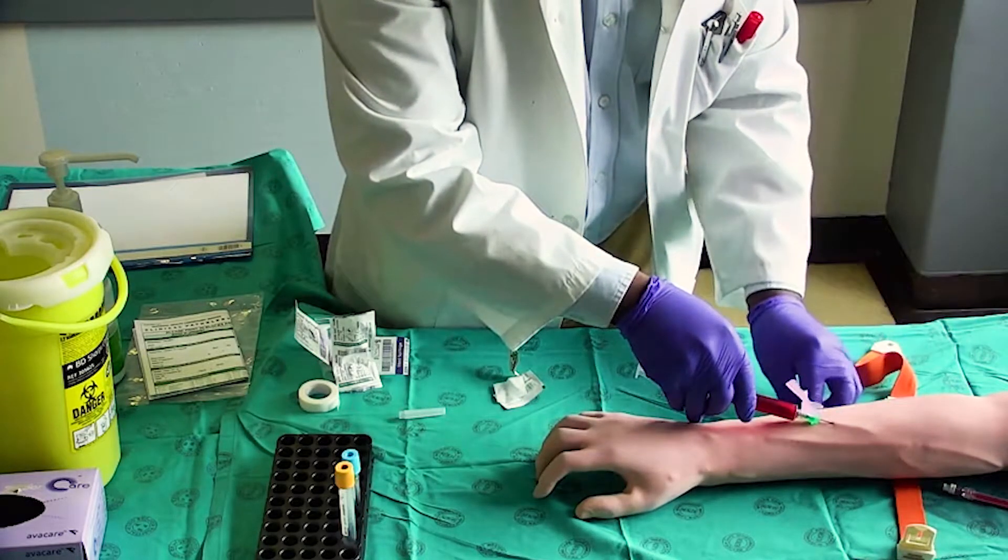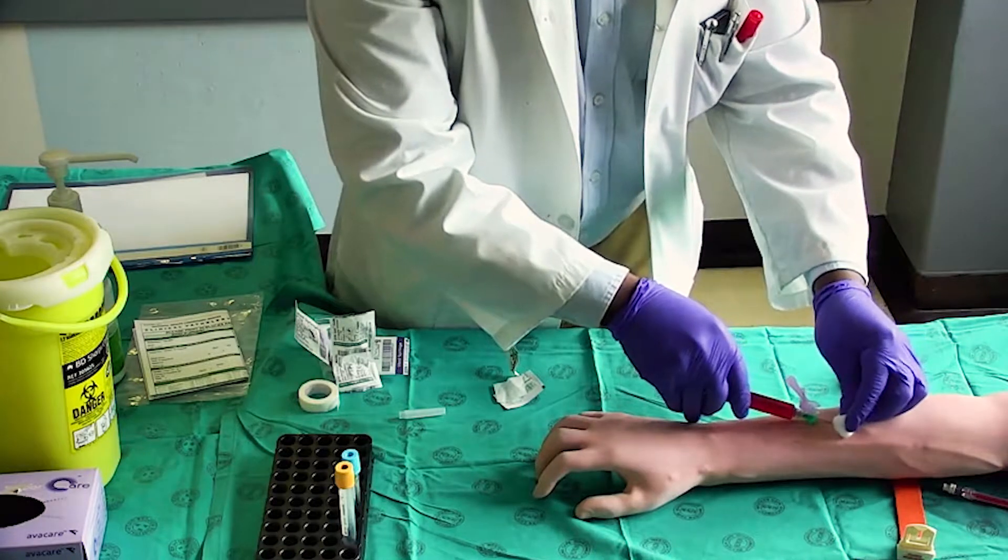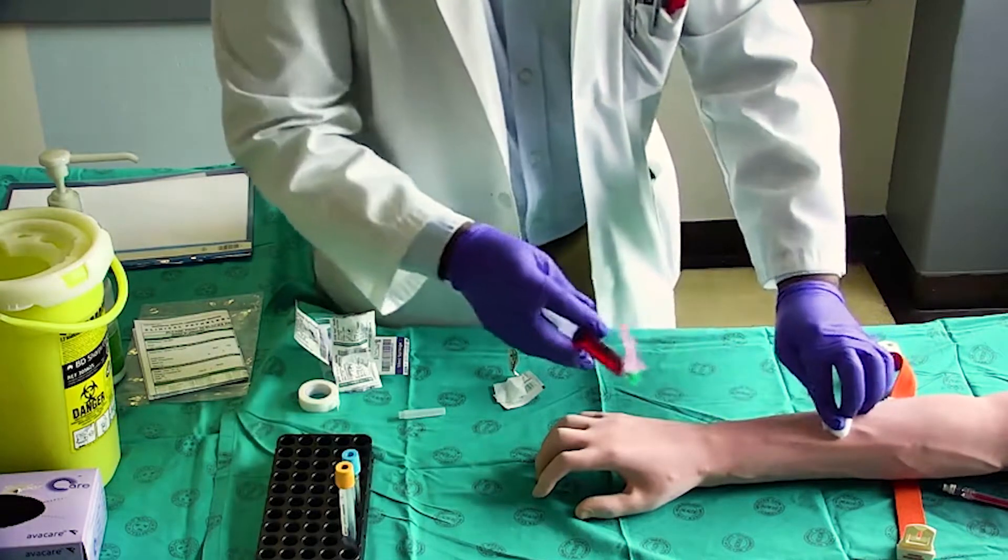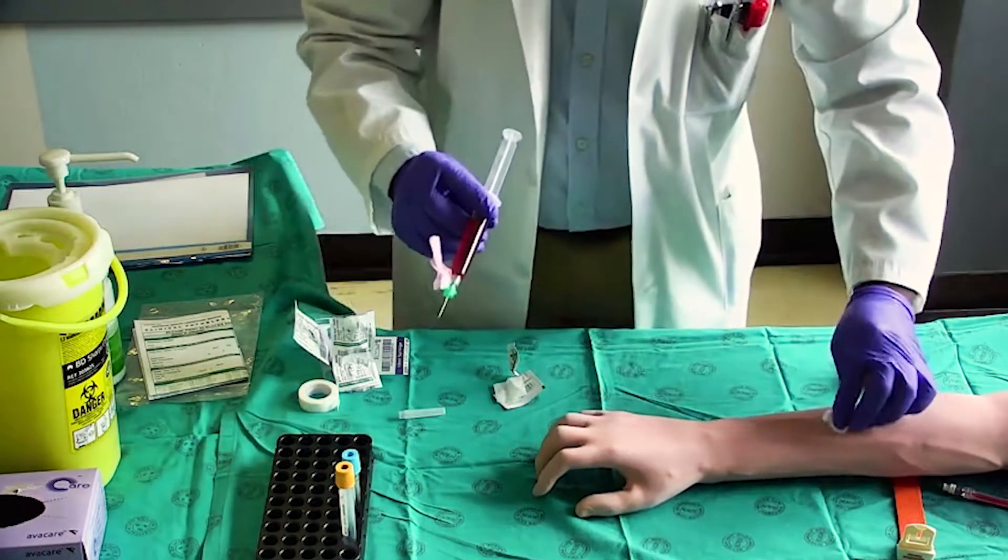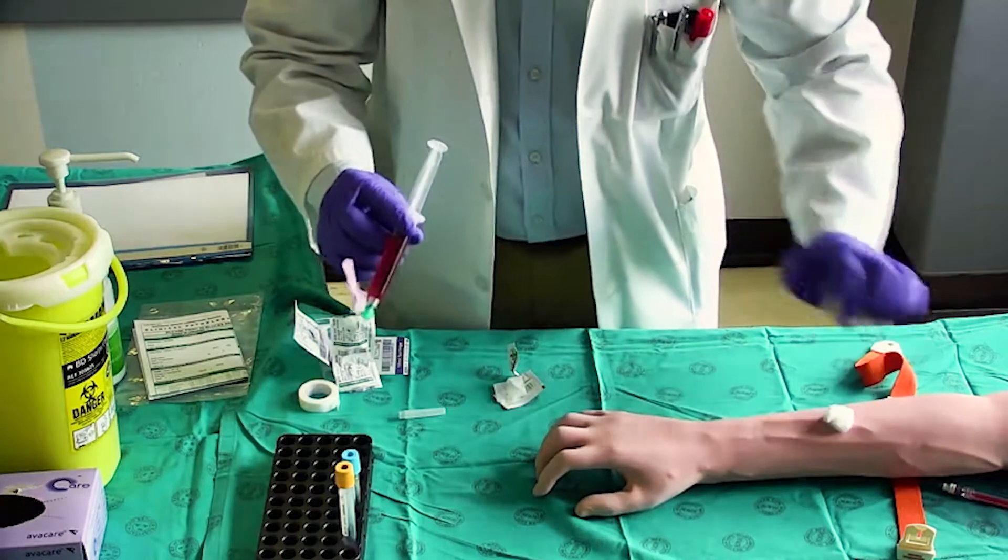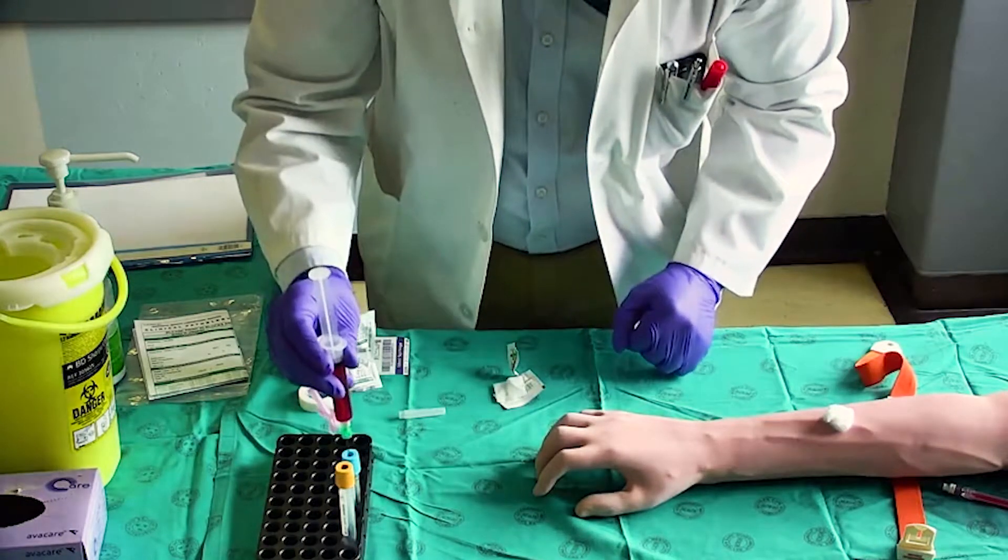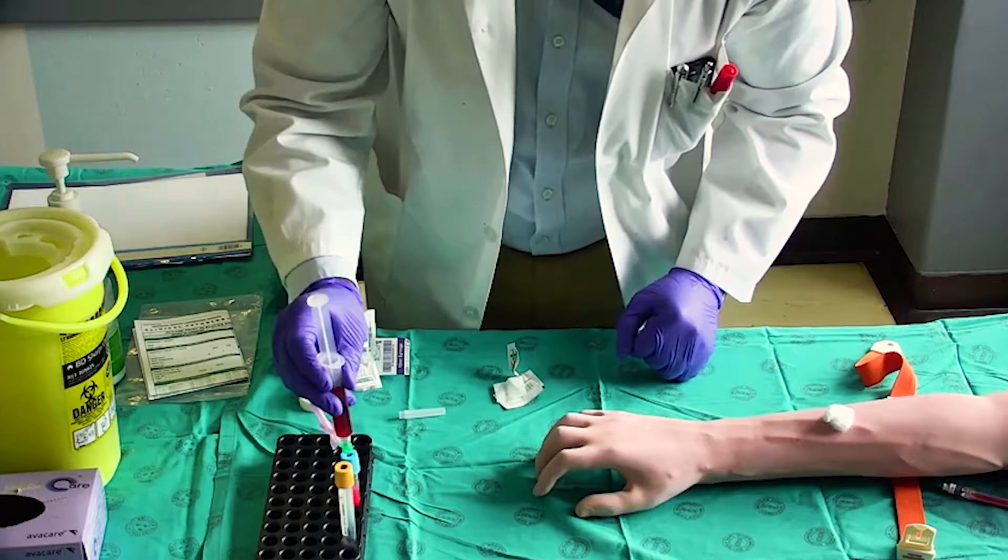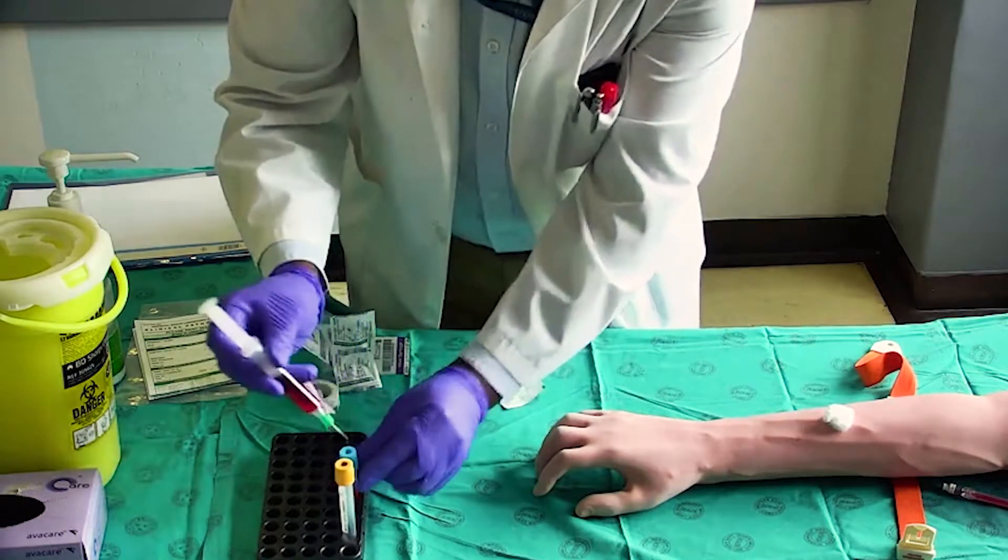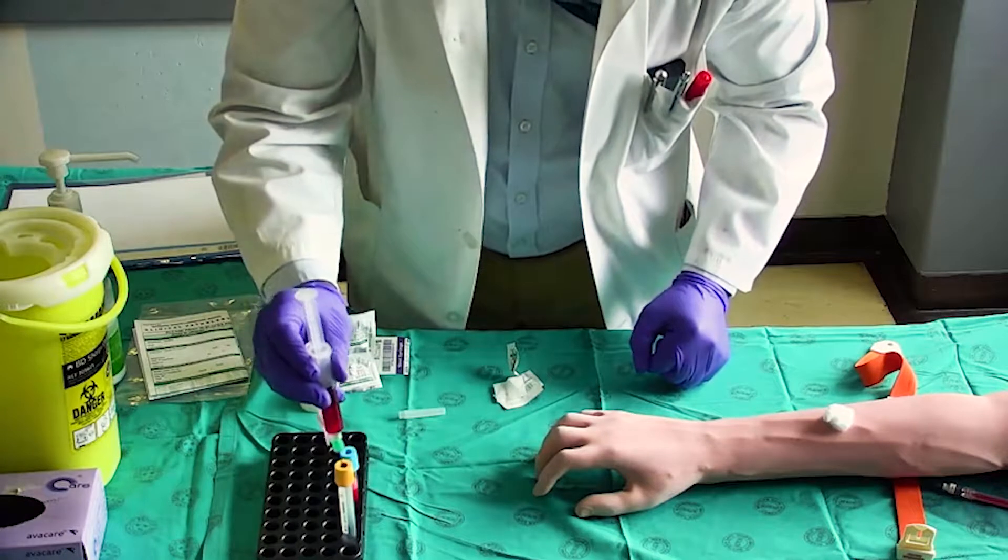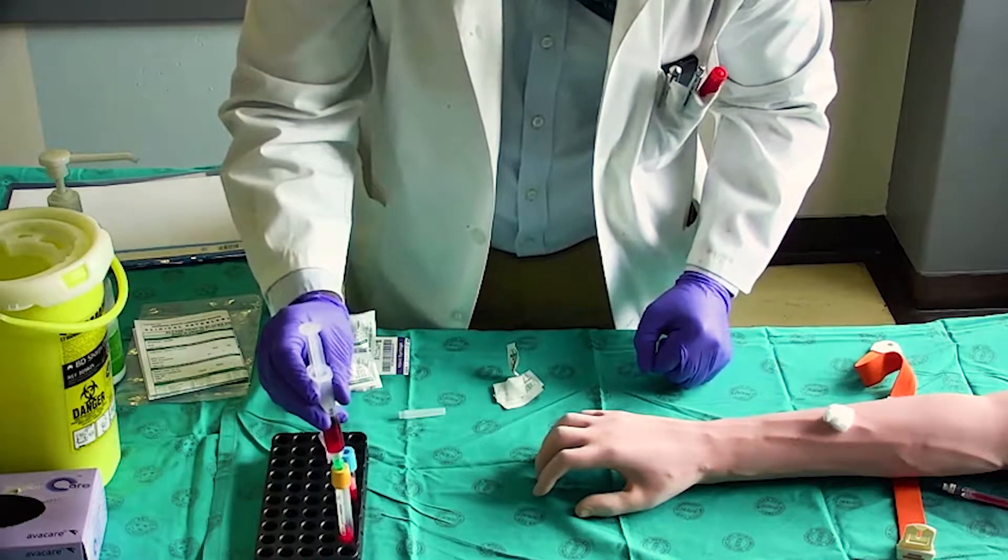Release the tourniquet and withdraw the needle gently. Apply pressure on the site with a cotton wool ball. Do not change needles between blood sample collection and the inoculation of blood into the tubes. Inoculate blood into the blood tubes. Do not hold onto the tube while inoculating as this increases the risk for a needle stick injury.